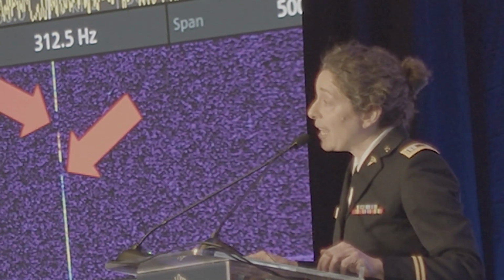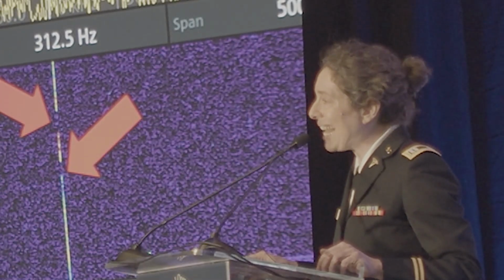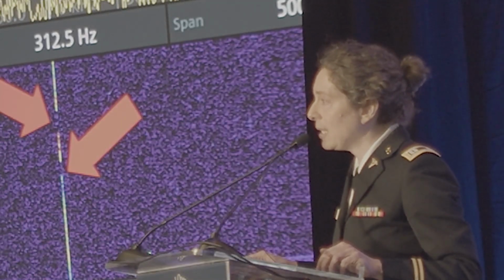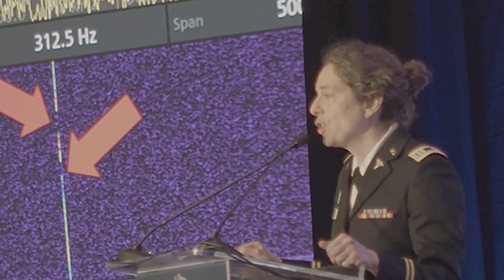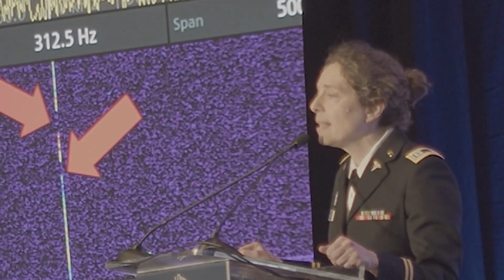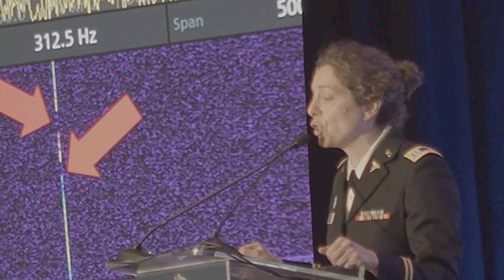The Butterfly IQ Plus probe had an electromagnetic signature that was detected at negative 135 decibel milliwatts. It also was barely detectable over baseline. But as you'll see, those red arrows in the purple field are just drawing attention to the fact that the signature over time is a little bit more pronounced than the signature that we saw with the Sonosite M Turbo and the Sonosite Edge 2.